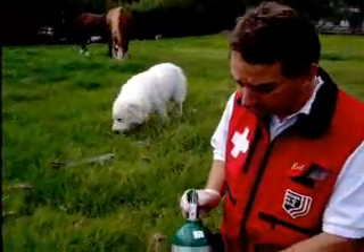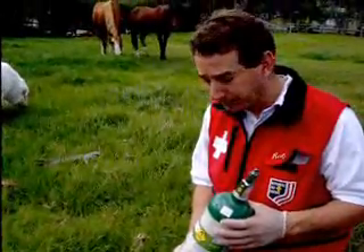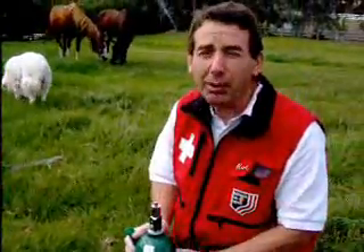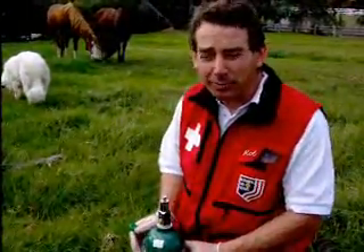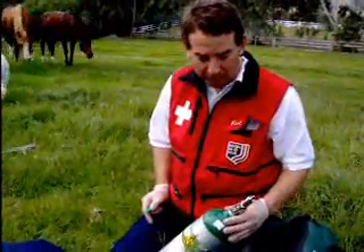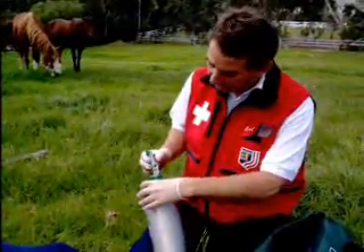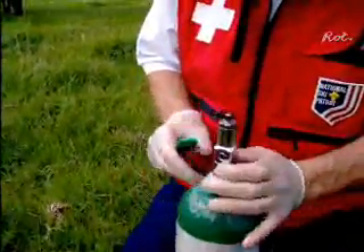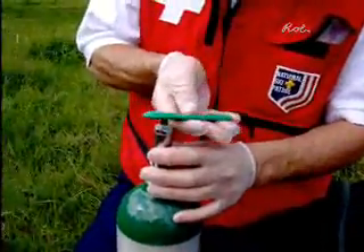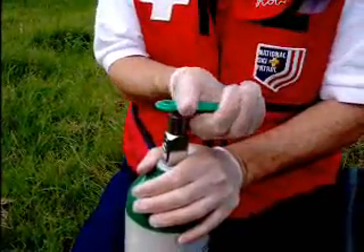So to administer oxygen, the first thing is you always want to control the oxygen bottle. You never leave the oxygen bottle sitting like that because it might fall over. So you make a spot in the snow or put it between your knees. When you take the oxygen out, the first step is to crack it and get rid of any dirt that might be stuck in the orifice. So put the top on and briefly open it up.